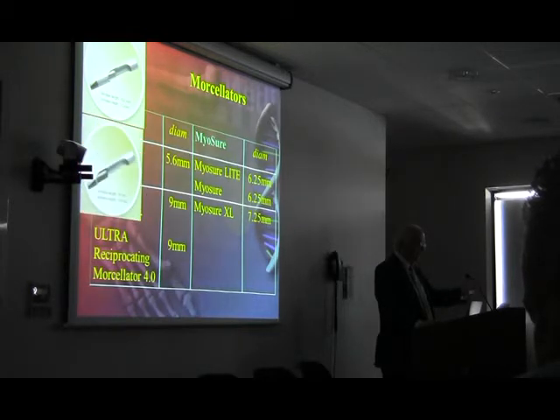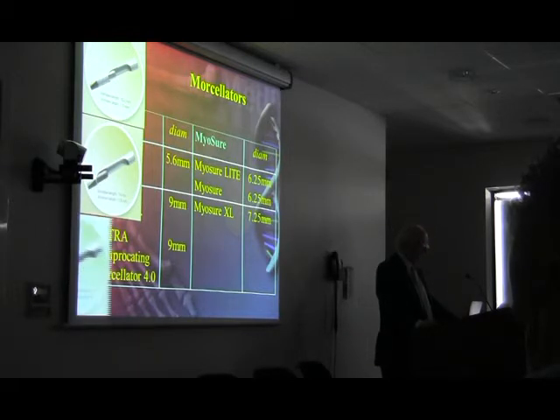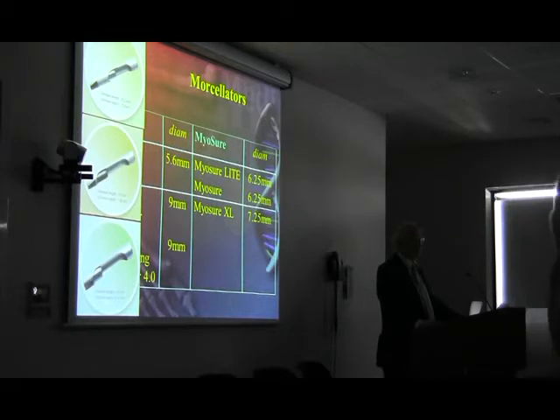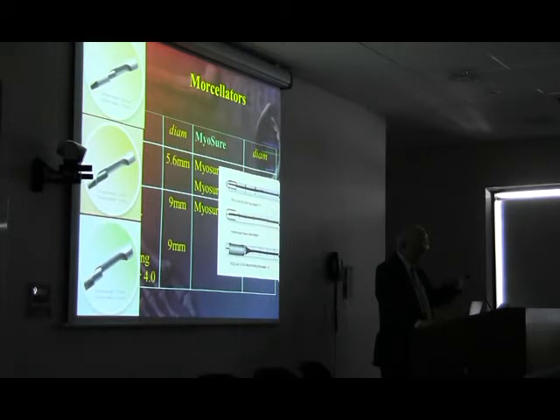This is the TrueClear. So you've got different sizes, 5.6 and 9. Now, with the 9, you're getting into serious business there for outpatients. So 5.6, easy enough. But that's the little working end of it where it works. Obviously it's the subject of a talk this afternoon, so I don't want to dwell on it too much.